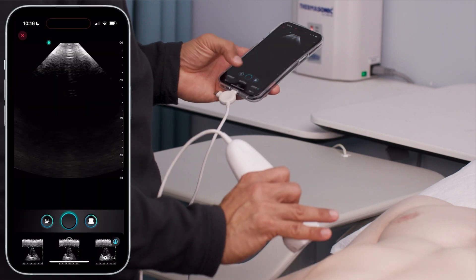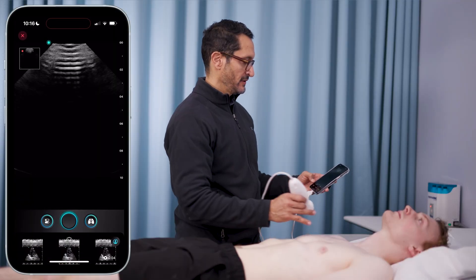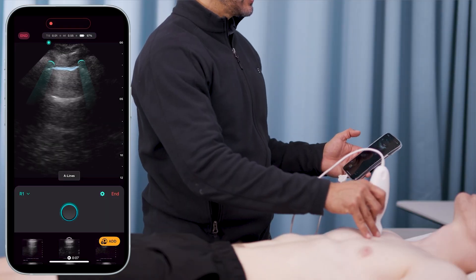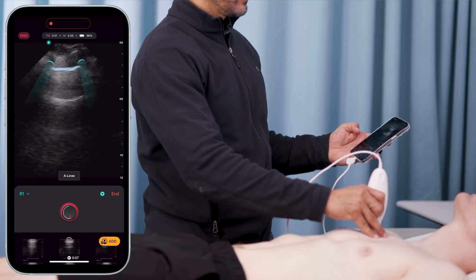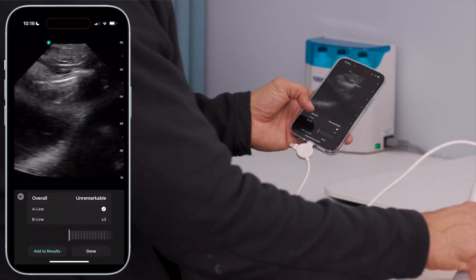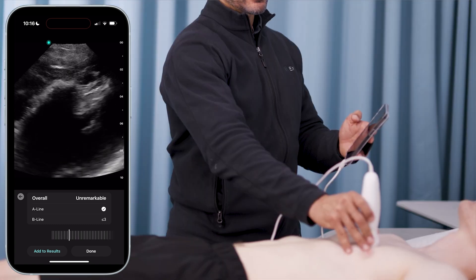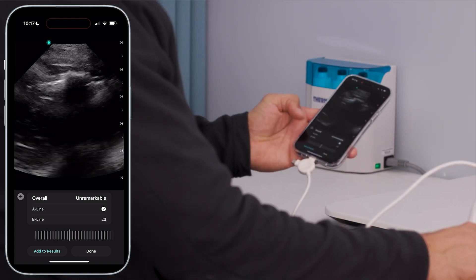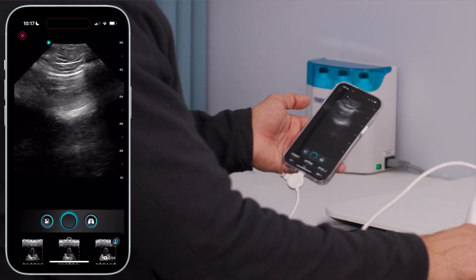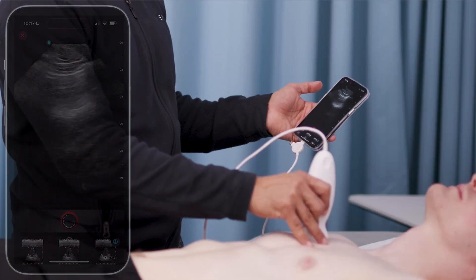I'm going to go over to his lungs — this is really going to blow you away. Just a simple click of a button, place it on his chest, fan to get a good view, click one button to measure, and then it clips it. That's it. A-lines are present, good lung sliding, and no B-lines. I can scroll back and look at the insights. This allows me to store these images, send them for feedback, or send them to my senior clinicians — getting measurements in one click.